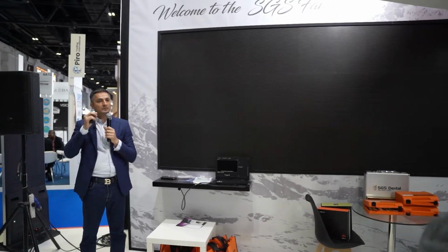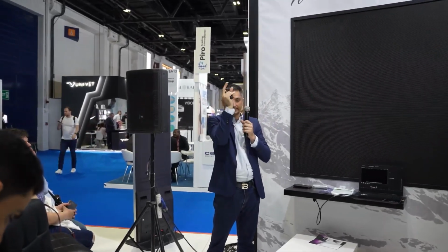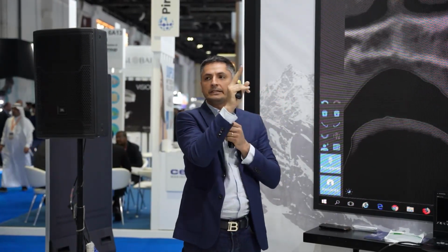I used the JD before. JD is the same as the P7. You know the P7 from SGS? The external sinus lift to this is the same. It's the same geometry for the implant. So for sure with the JD, you have to do the same as what I'm doing. There is a clinic in Dubai that is placing the JD the same way. And even the JD, I think it has a higher insertion torque.